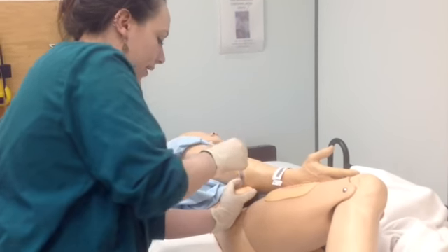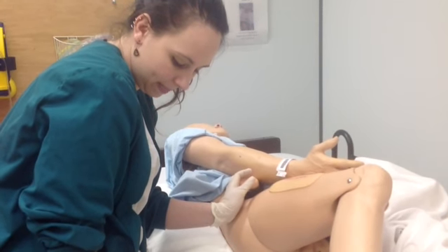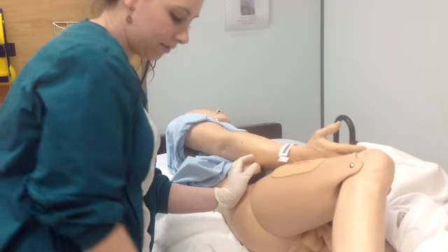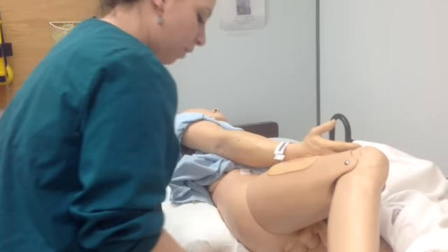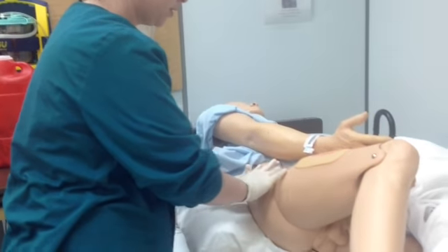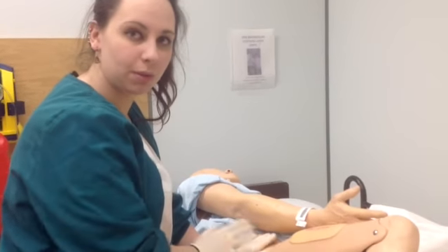And when I pull it out, I'm going to point it down away from everyone. And I'm going to block the safety this time so that it can't come back off. While I would be doing that, I would also have the pad put pressure. Do not massage it. You just want to put a light pressure.